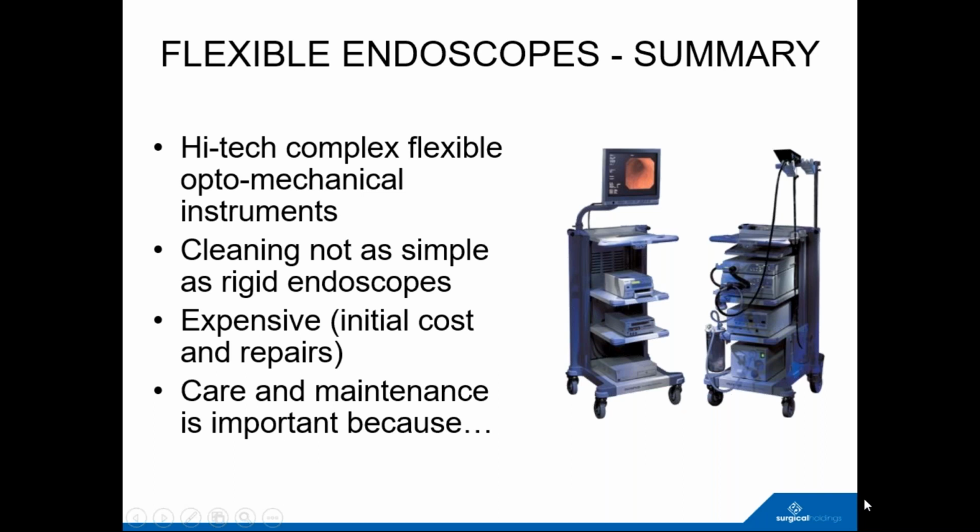They will break down at some point in time. So, great, thank you. To summarise, they are high-tech, complex, very state-of-the-art in terms of what you can get inside an instrument of that size. Optomechanical instruments: you need very good optical technology, but also very good mechanical technology to get the tip of the instrument into the area of the body that you want. The best example of that is probably colonoscopes.